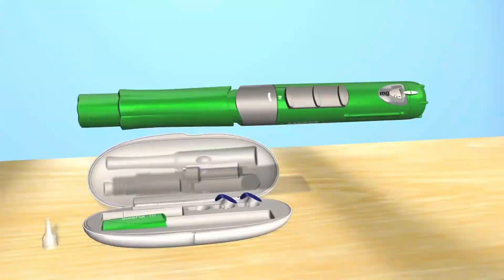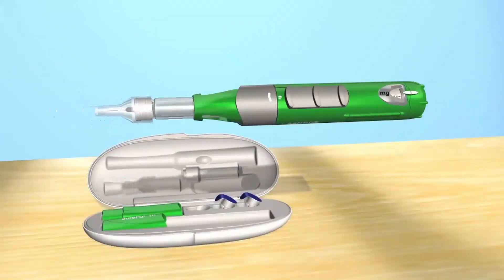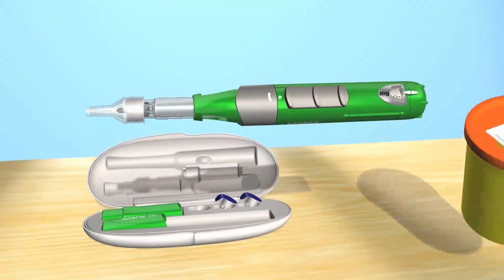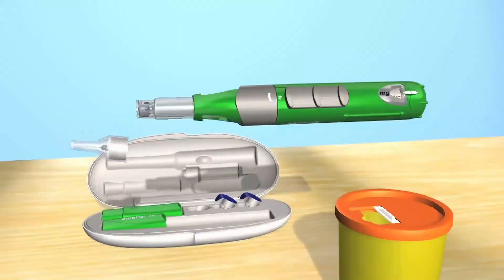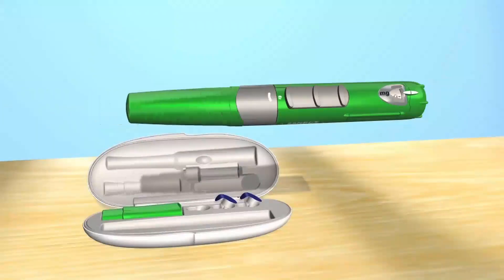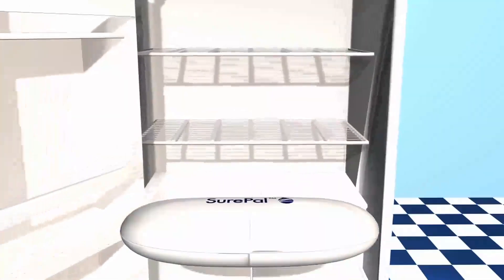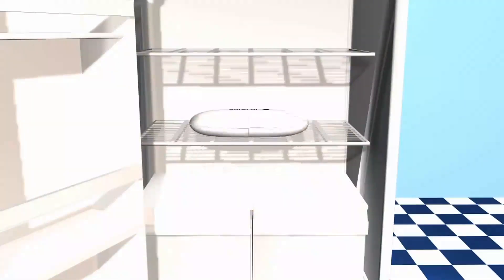If you've used the needle hider, remove it by pulling it straight off. Whether or not you've used the needle hider, carefully attach the outer needle cover that you took off earlier. Holding the SurePal by the locking ring, unscrew the covered needle and immediately discard it in a sharps box. Never leave the needle attached when storing the SurePal and never reuse a needle. Leaving the preassembled cartridge on your SurePal, reattach the pen cap and put your SurePal back in its hard case.